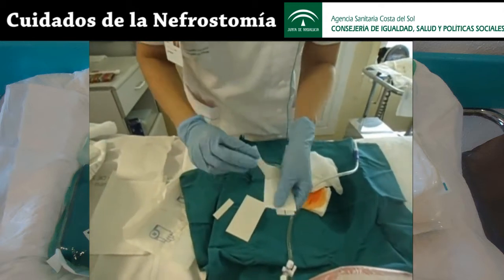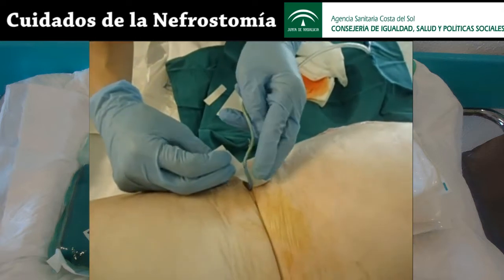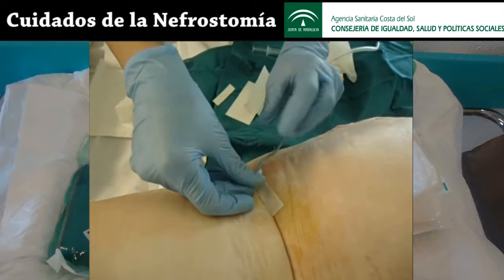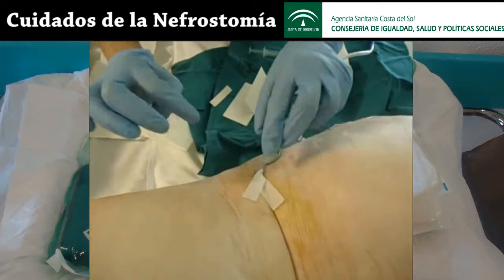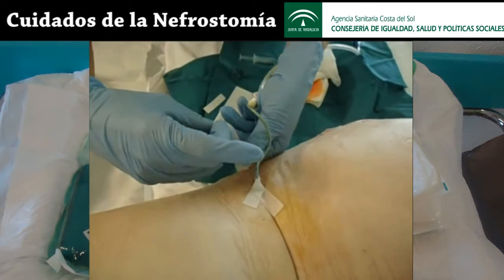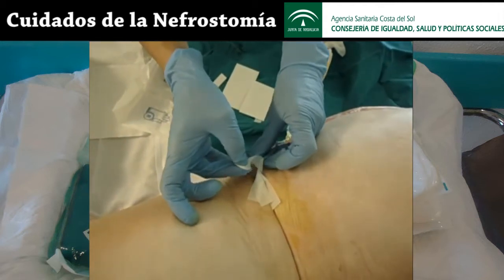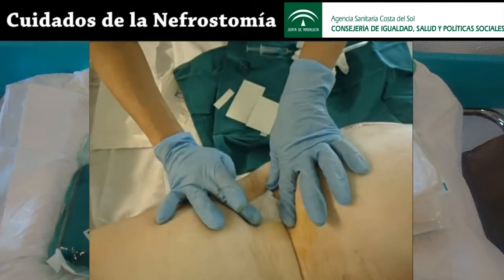Use the adhesive strips to fix the tube to the skin. It is essential that the patient does not make any sudden movement that may tug on the catheter and make it come out. Place the adhesive strips in a bow knot.